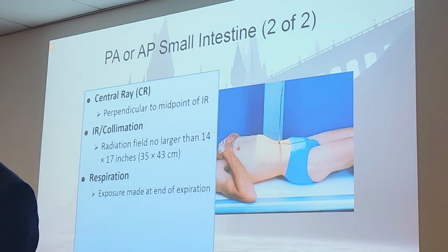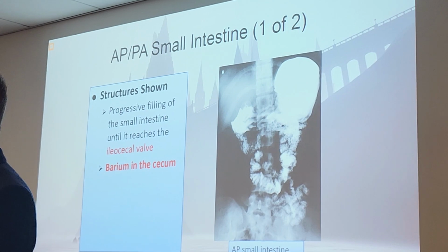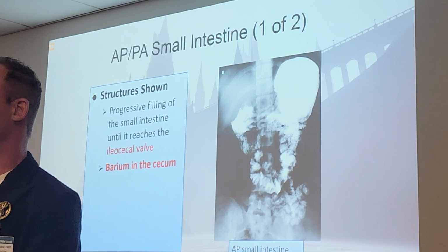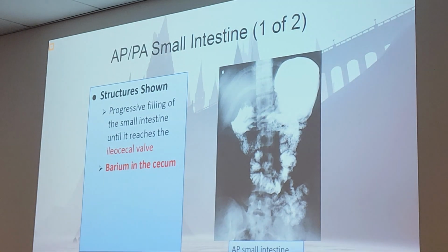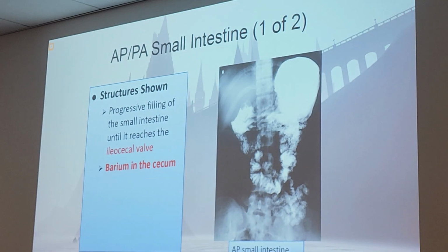Okay, so perpendicular central ray, we're still doing the films on expiration. And what do we want to see, guys? Progressive filling of that small intestine until it reaches that ileocecal valve. And ultimately, we do want to see the barium in the cecum. It tells us that the procedure is done. We have finished.